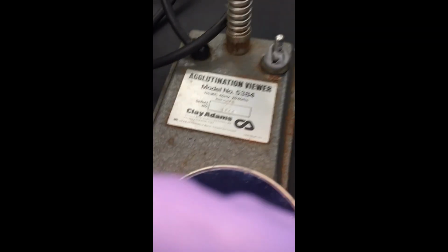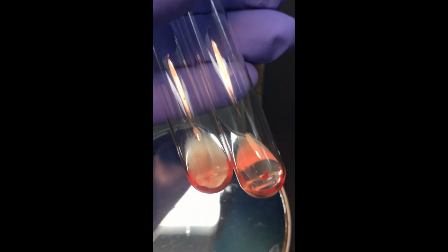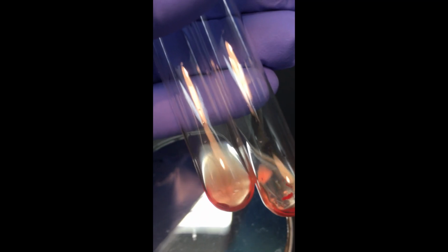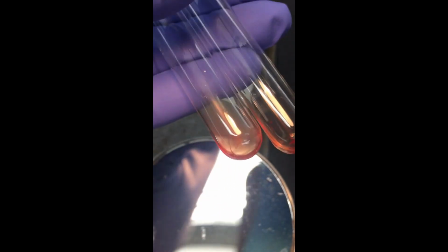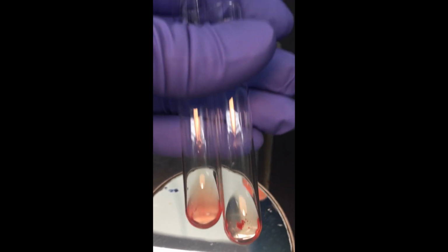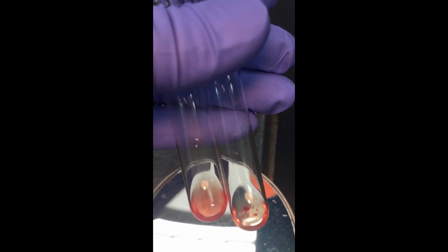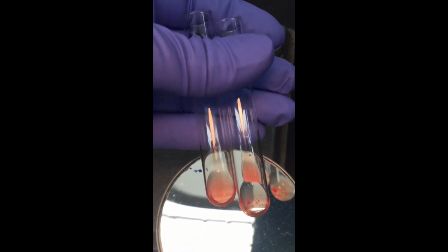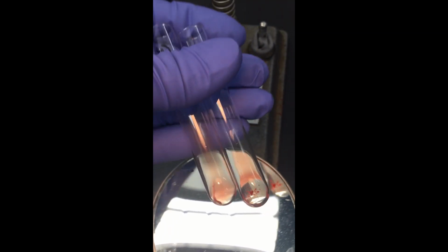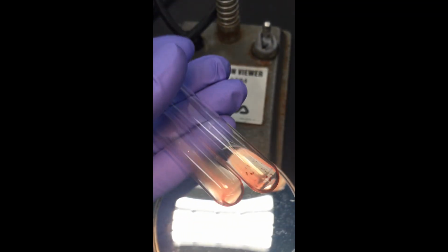Tubes 3 and 4. All right, tube 3 is on the left, and tube 4 is on the right. You can still see the cells swirling off.